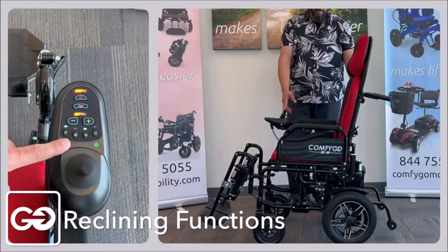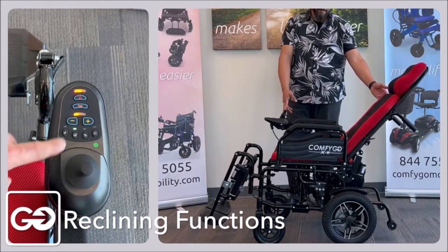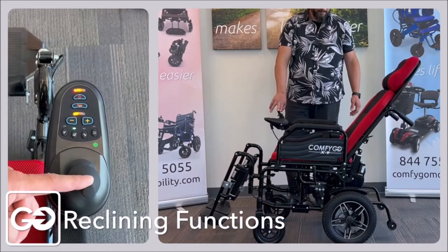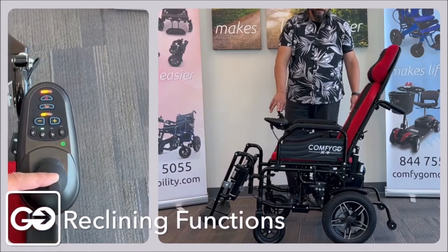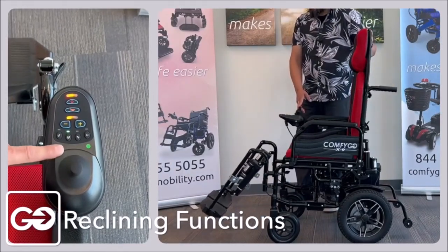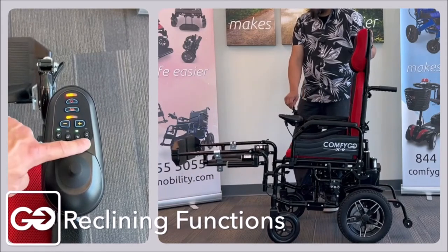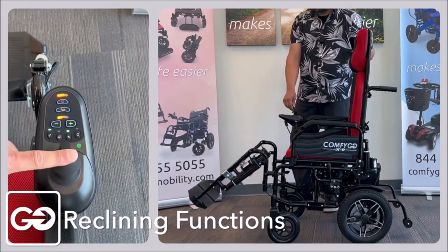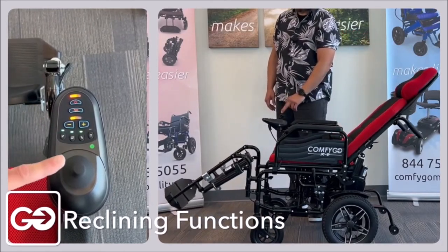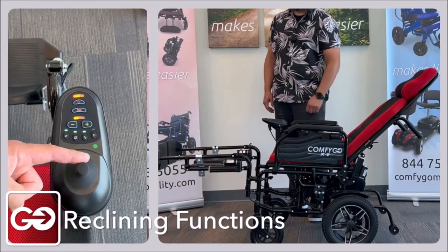Now we're going to change the control to the backrest by pushing this button in the middle. When we do that, the two legs turn off and our backrest turns on green. The same thing applies — using the controller, we can lower and raise the backrest. Another feature of this controller is the ability to group the legs with one press of the square button, which controls both legs together, or one more press of the square button to group all three together. Now the backrest goes down and the leg rests rise up simultaneously.